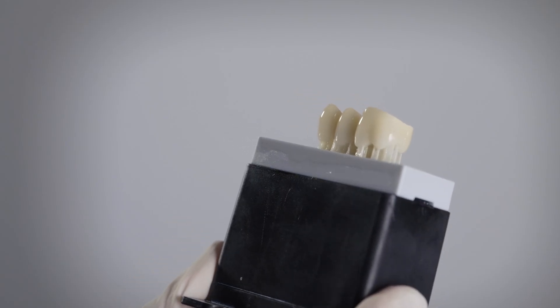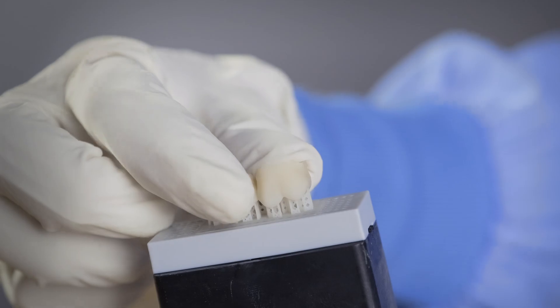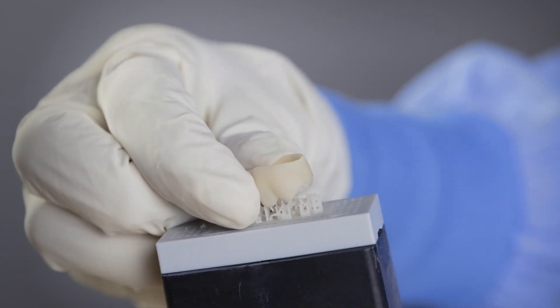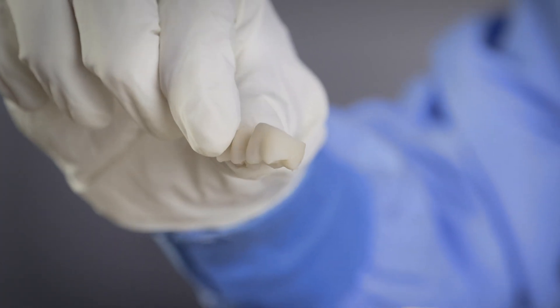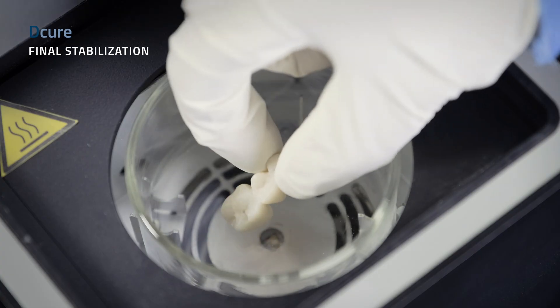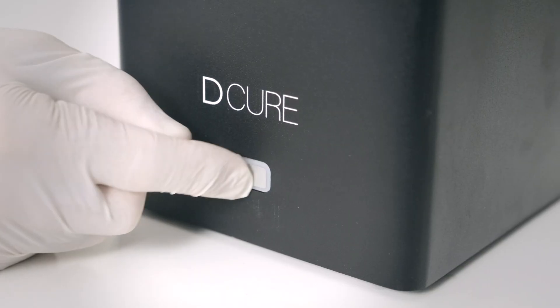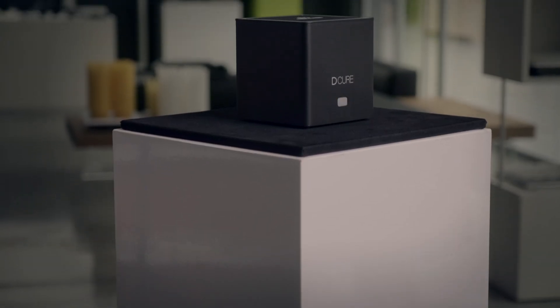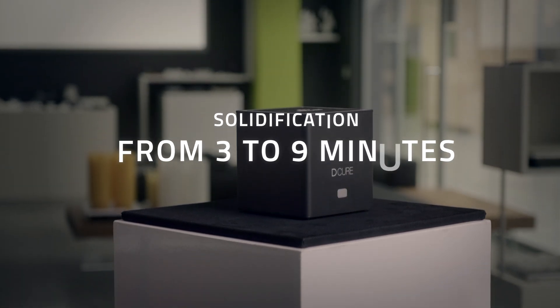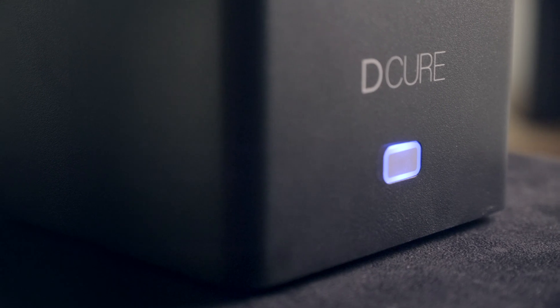At the end of the printing process, after a simple washing in ethyl alcohol, the prosthesis can be easily separated from the supports thanks to the patented breaking points and placed into the new D-Cure device dedicated to the final stabilization of the restorations. Through the combined action of UV light and heat, D-Cure ensures the perfect solidification of the restoration in just six minutes, preserving both color and gradient.